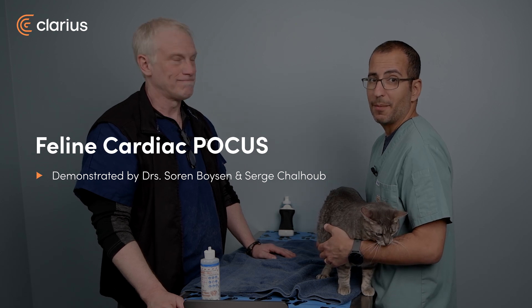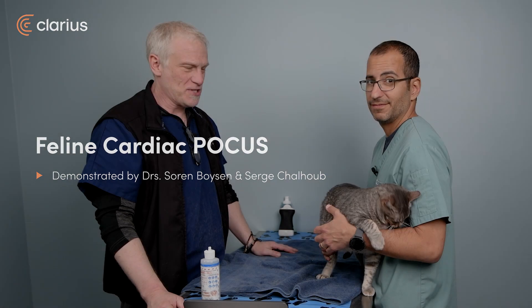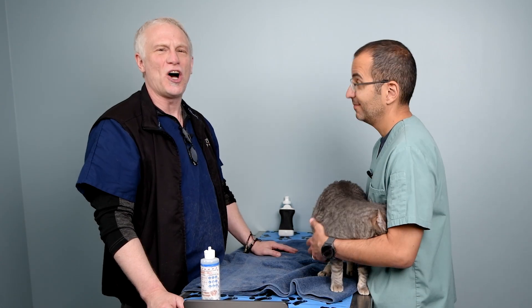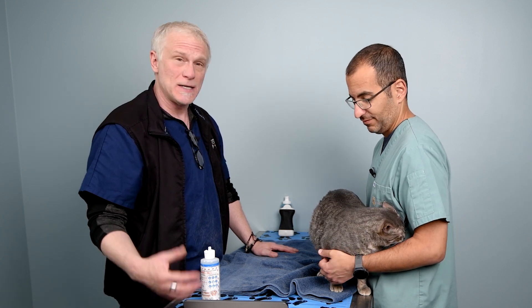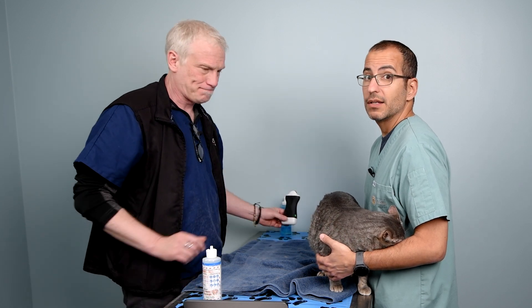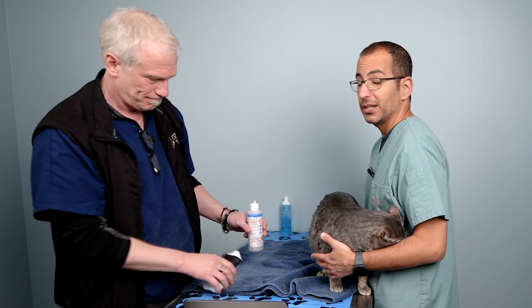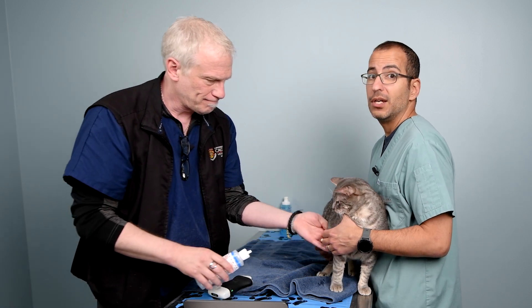Hello everyone and welcome back. I'm Serge and I'm Cern, and we're going to finish up our session by looking at the heart of our cat. We're going to do our cardiac point-of-care ultrasound evaluation. We're going to assess the heart predominantly off the right parasternal site in short axis. Now, compared to dogs, looking at the heart in cats can be a little tricky — you essentially want to put the probe in the right orientation.